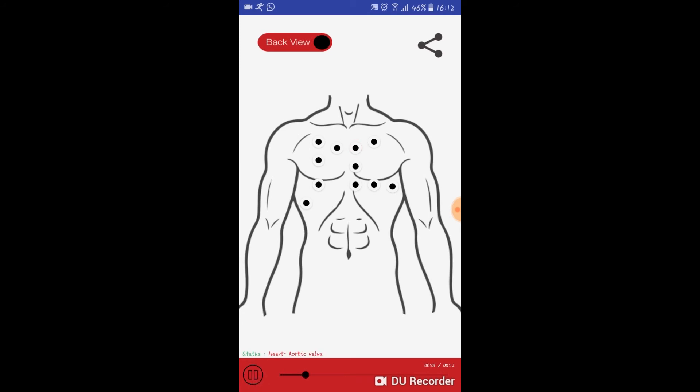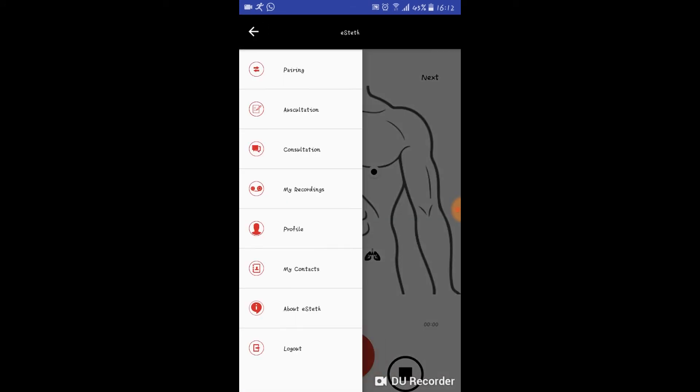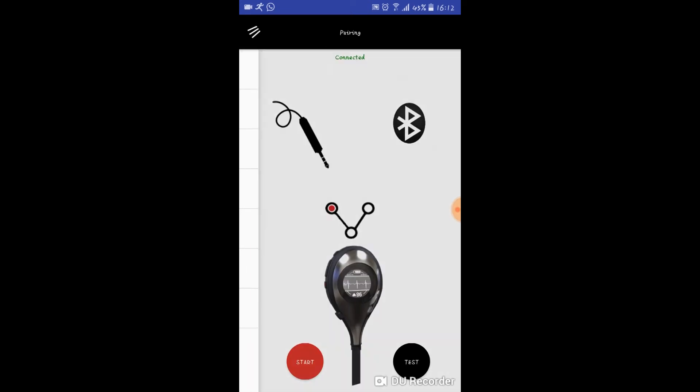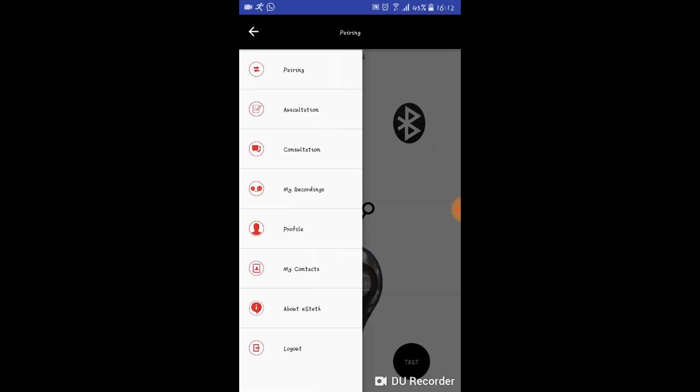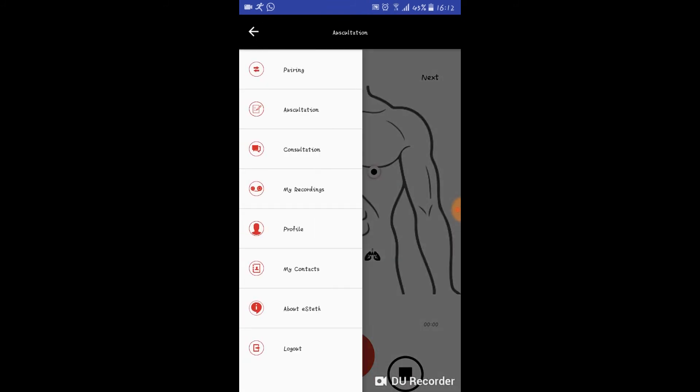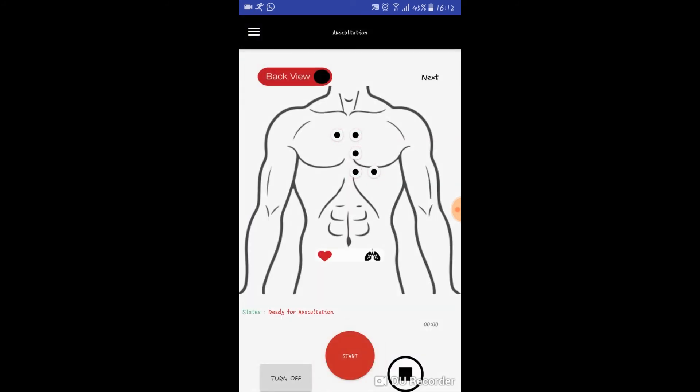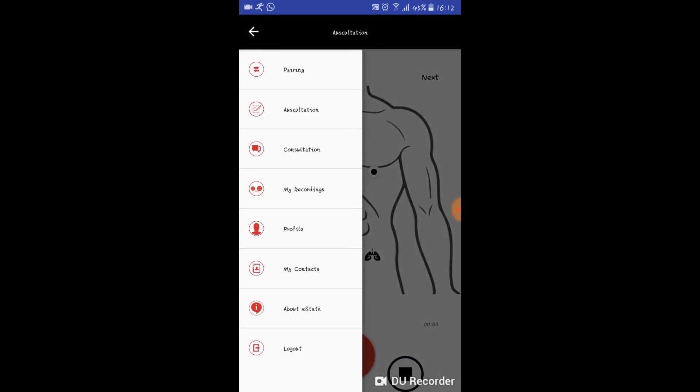If you click the sidebar of the e-steth application, you will be able to see multiple options like my recordings, profile, settings, my contacts, and more information about e-steth. If you want to hear your previous recordings, you can simply go to my recordings and then play any of those sounds.